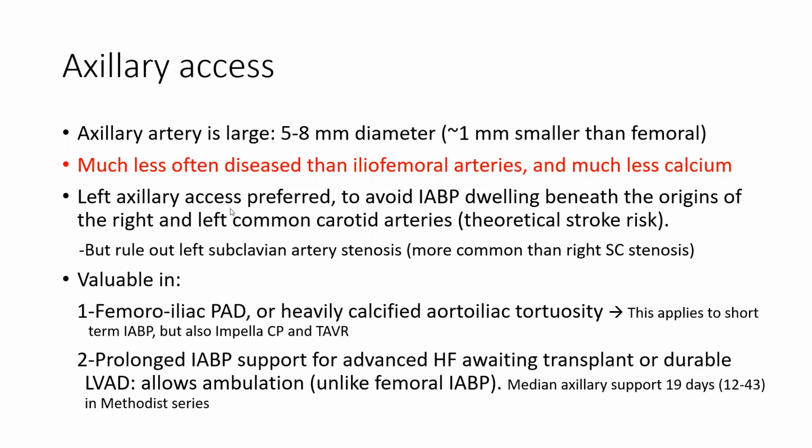However, keep in mind that even though the axillary artery is rarely diseased or stenosed, the left subclavian artery may very well be stenosed in patients with PAD and CAD. So you need to rule out left subclavian artery stenosis when you want to do left axillary access, especially that the left subclavian stenosis is more common than the right. And the way you rule that out is at the very least by checking blood pressure in both arms.